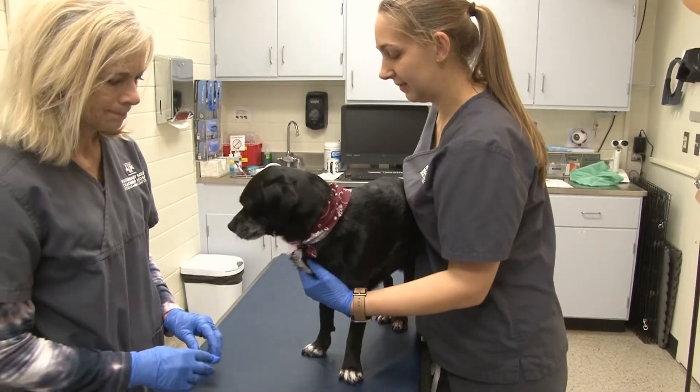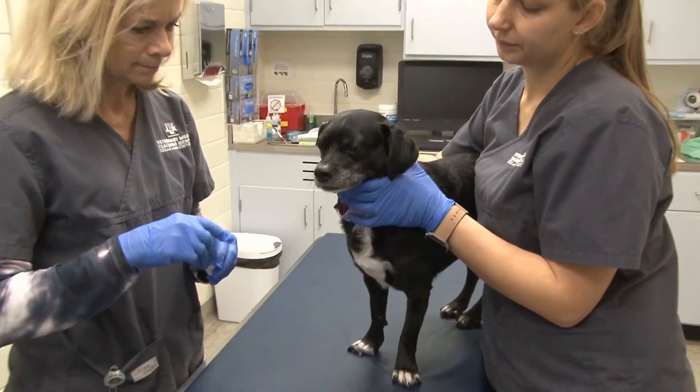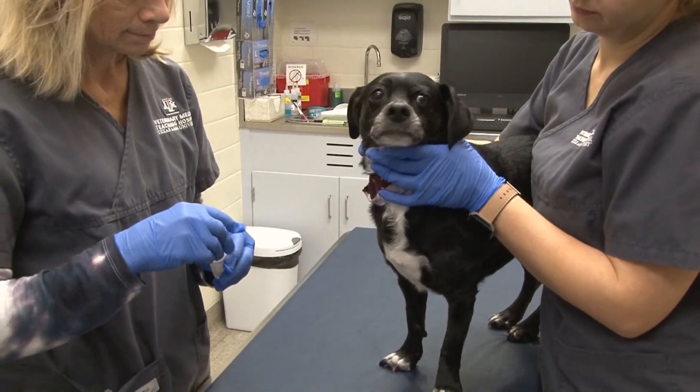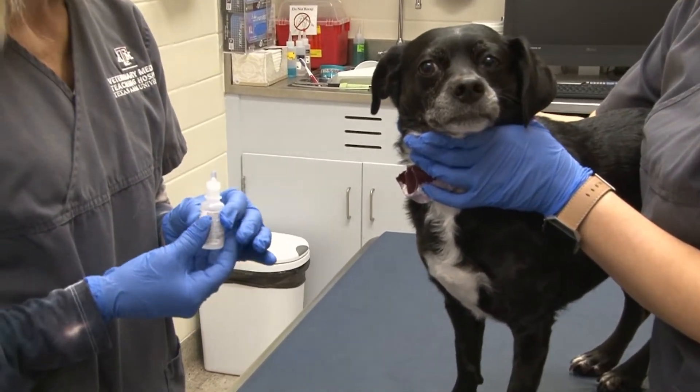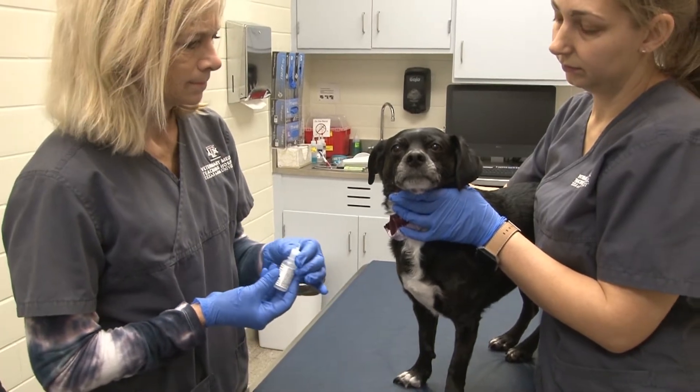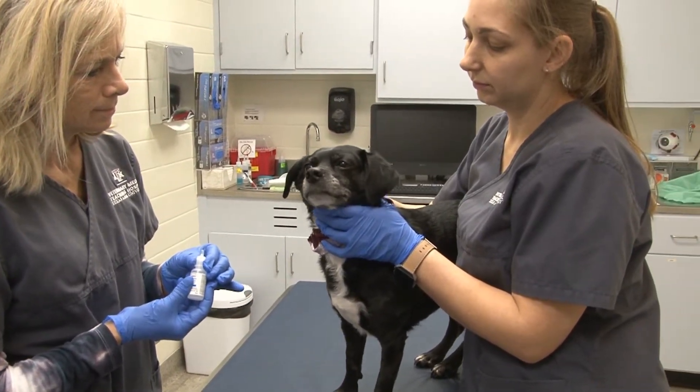The technician is now going to open the ophthalmic medication prior to opening the eyelids. She's going to make sure she understands the amount of medication to give. After she opens the medication, she's going to place the cap on a clean surface.